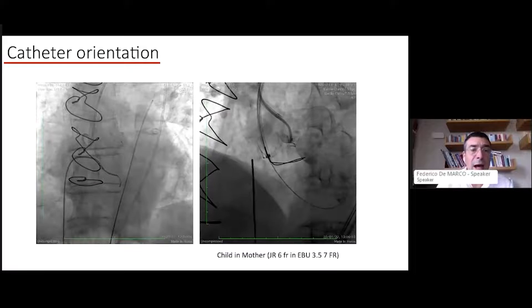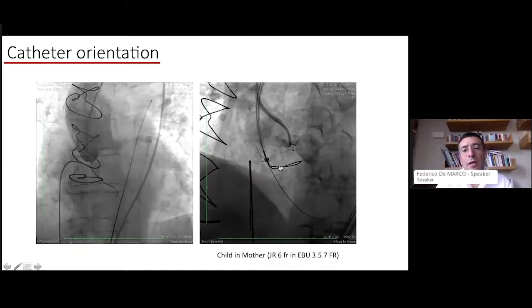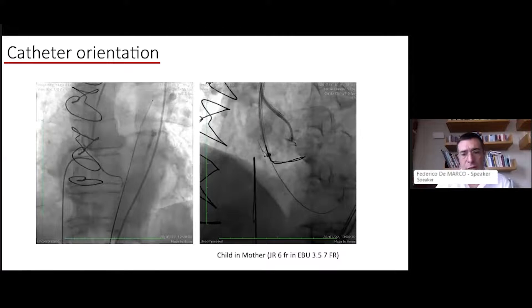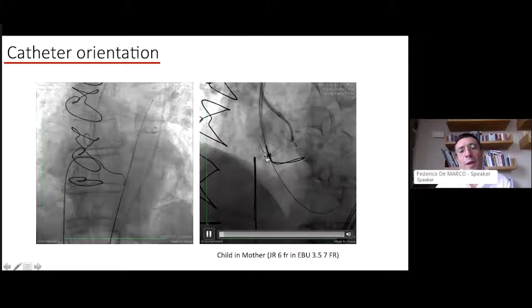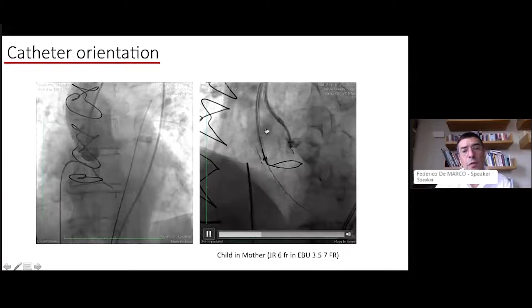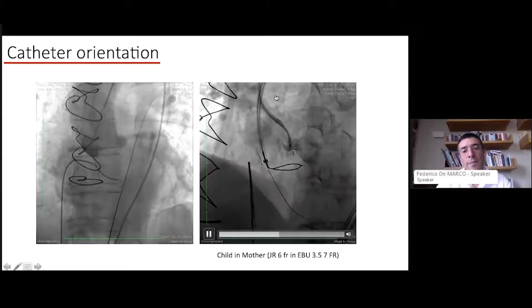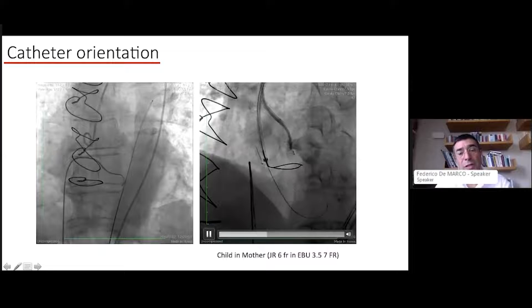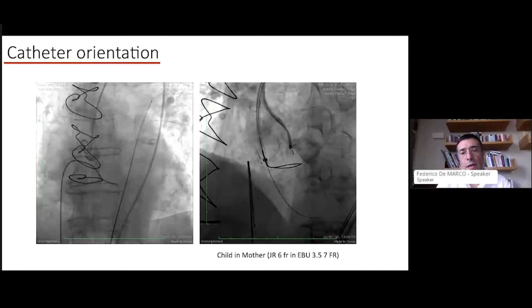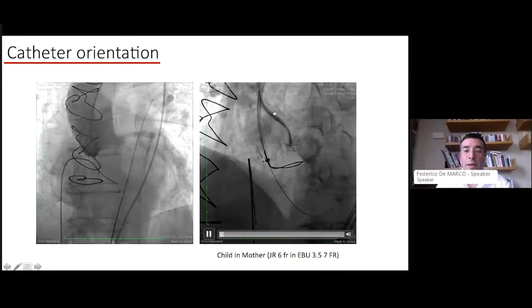Let's go through the BASILICA technique steps. On the baseline angiography you can clearly see how the degenerated device extends above the STJ and that both coronaries are quite low. The first step is to place your snare in the LVOT — choose a snare approximately the size of your LVOT or slightly larger; in this case we chose a 20mm snare. Also place a backup wire in the LVOT using a 0.025 wire to maintain access to the left ventricular cavity.